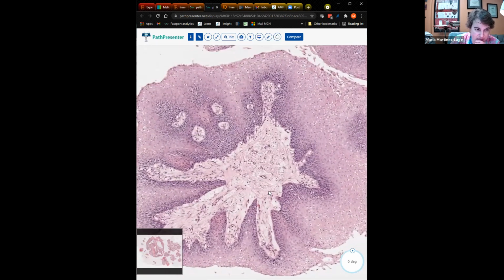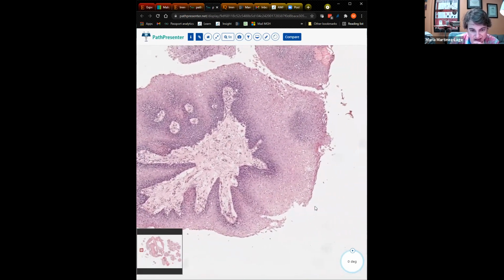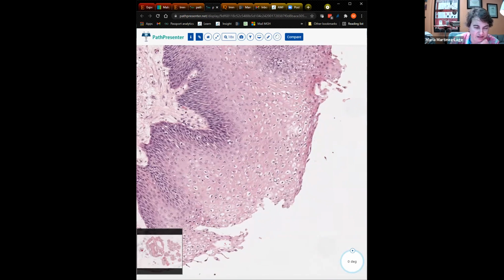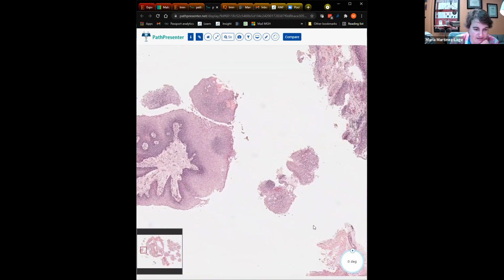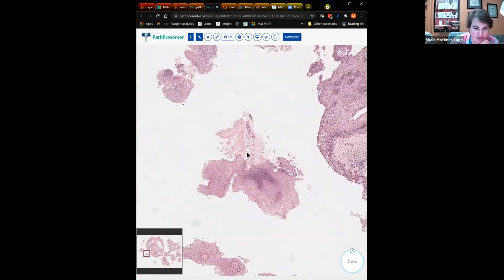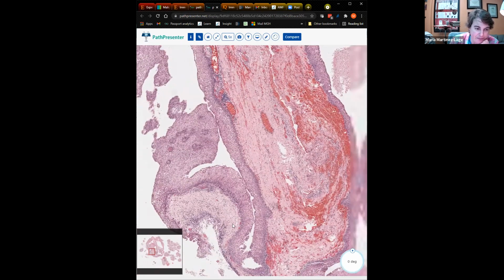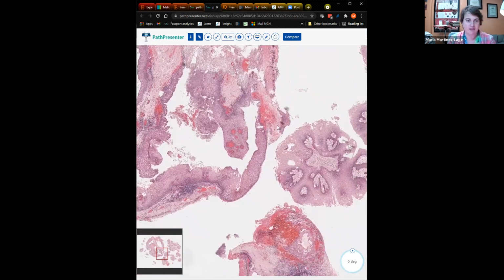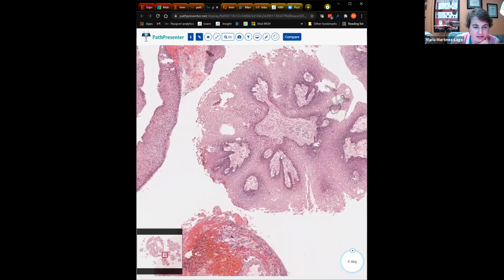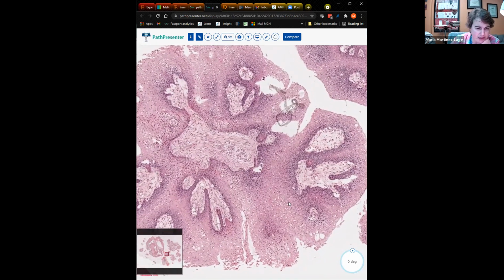So that's pretty much all there is to it. There's no wet keratin. Typically there's not a lot of dry keratin either. There's no particular palisading of the nuclei. They're almost never calcified. I mean, I guess they can be calcified, but they're not as frequently calcified as adamantinomatous craniopharyngiomas. And these are more common in adults than in children, but they're not exclusive, just like a lot of other things. And they are characterized by BRAF V600E mutations too.